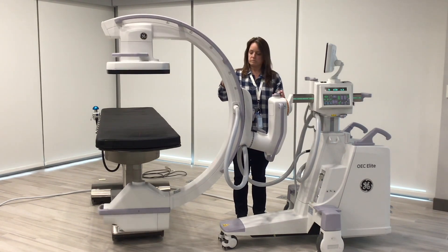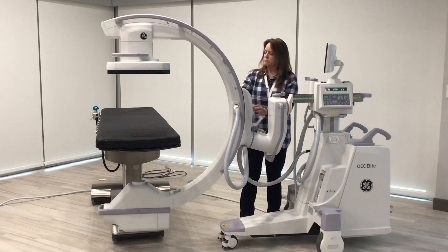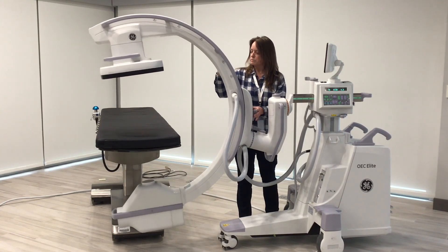Sometimes, even in this process, you may need to use your AP to lateral lock to line up your spinous process in the middle. You can unlock your lateral lock and do a little bit of over-scan or under-scan to put your pedicle and your spinous processes in the middle of your vertebral bodies.